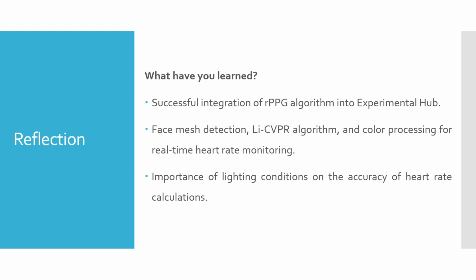Finally, from our real-world testing, we found that lighting conditions like warm versus cold light temperature and background lighting have a great impact on HR detection by the algorithm.